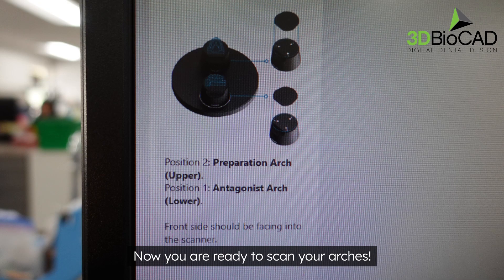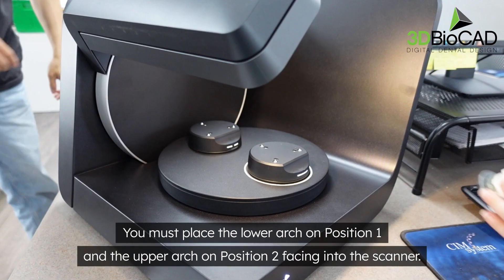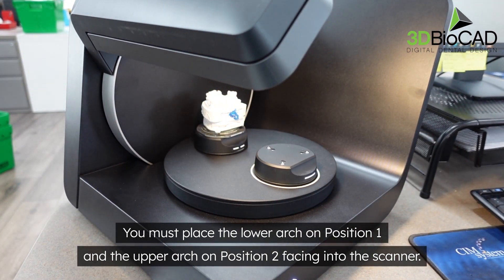Now you are ready to scan your arches. You must place the lower arch on position one and the upper arch on position two, facing into the scanner.